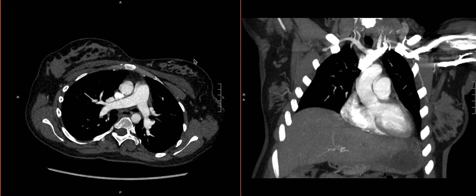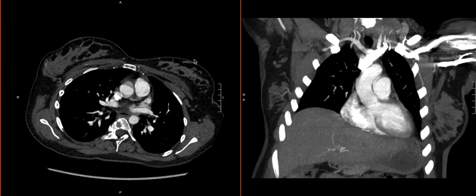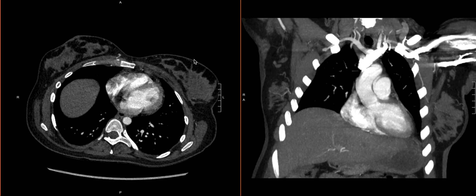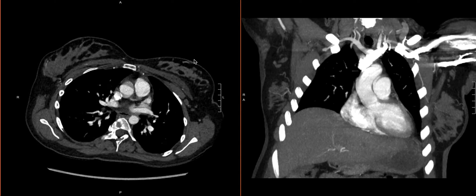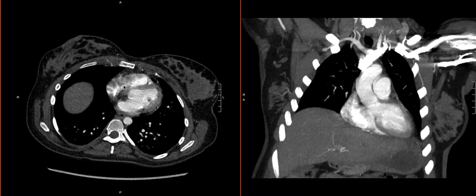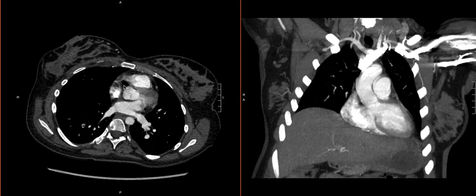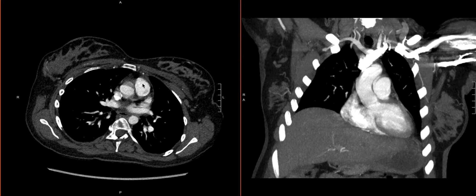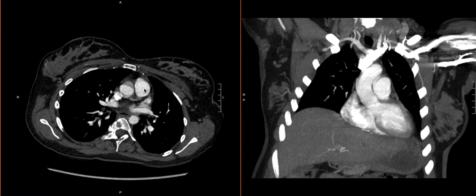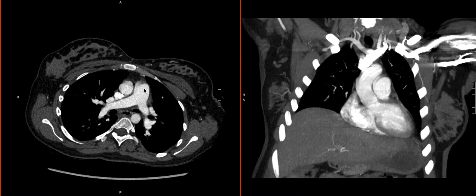Now we're ready to actually evaluate the pulmonary artery and trace it out so we can look for filling defects that are suspicious for pulmonary emboli. It's very useful, especially early on, to have a very systematic approach to how you do this. It's probably worth starting with the right ventricle and then going right out to the main pulmonary artery, the trunk, making sure that you start at the beginning and have a very systematic approach of actually tracing the vessel.